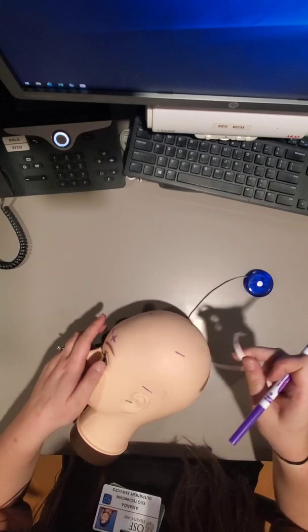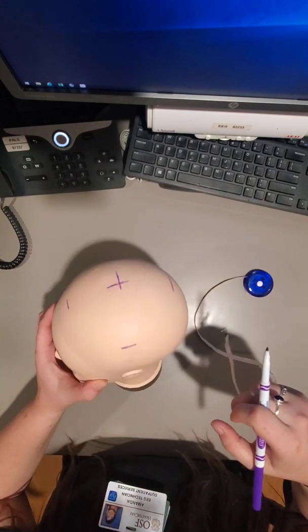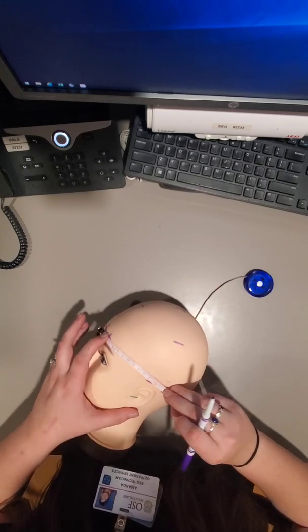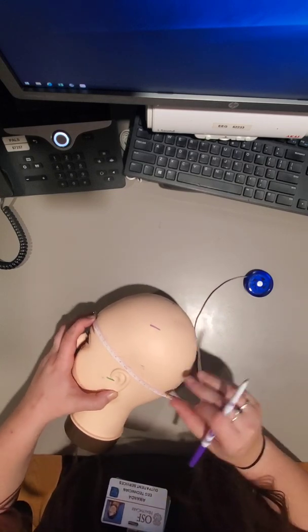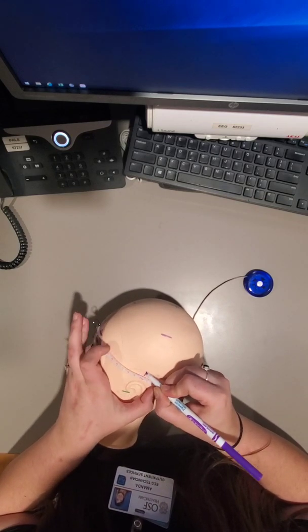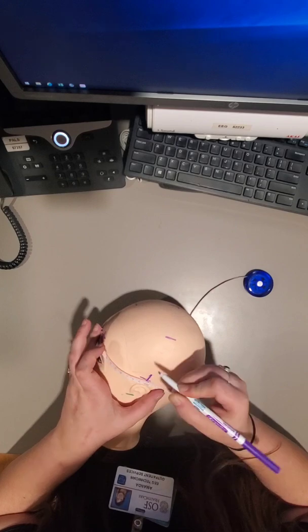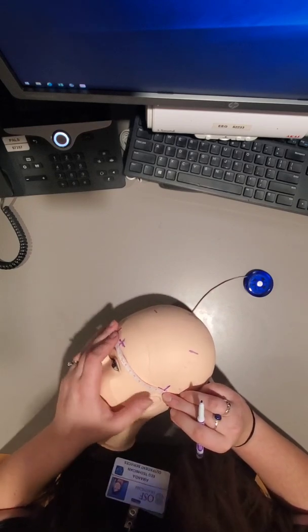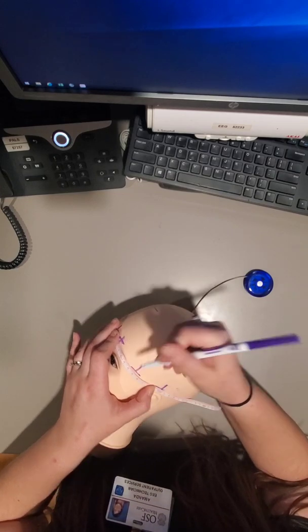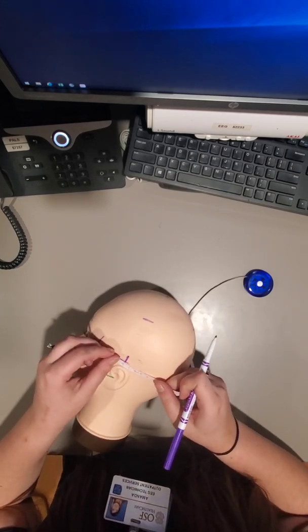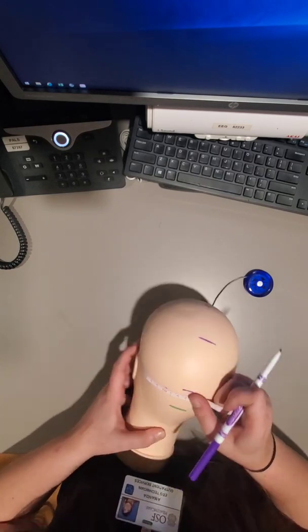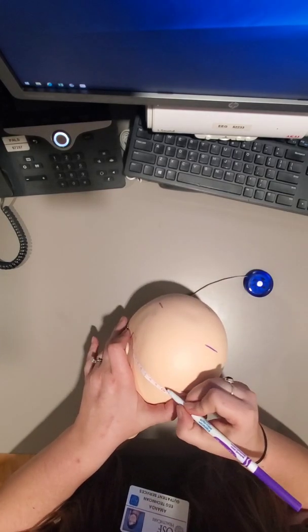Then I'm going to measure FP1 and put a mark here at the 10. And measure, put another mark at 5.